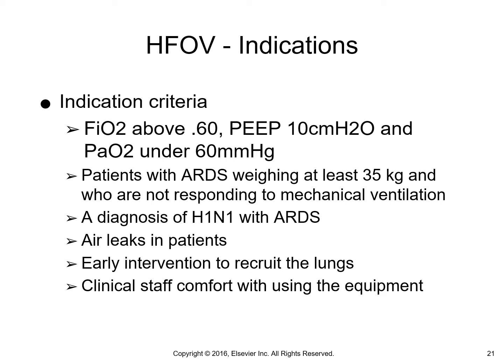Unfortunately, that's where it might get a bad rap, is how I feel, because a lot of these more extreme types of ventilation, APRV, the oscillator, nitric, you find they don't use until late in the course of the disease or the ARDS. If we can jump on this and get going with it sooner in the process, we might have better success.